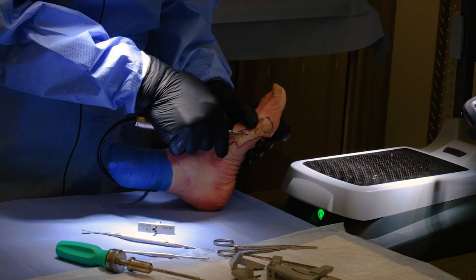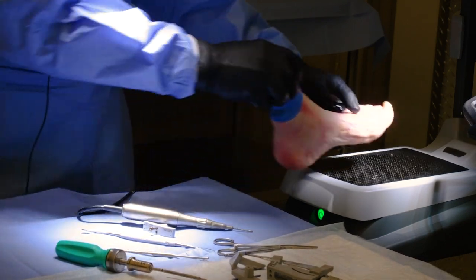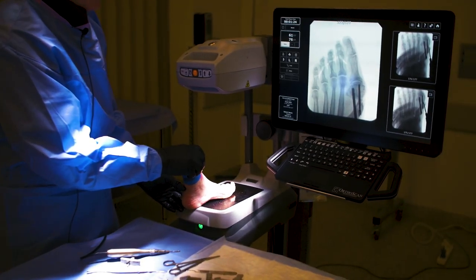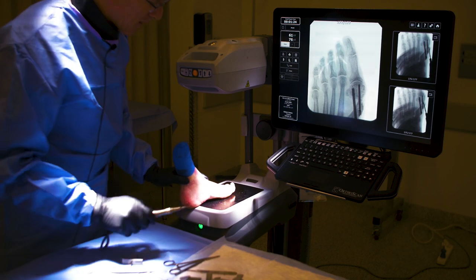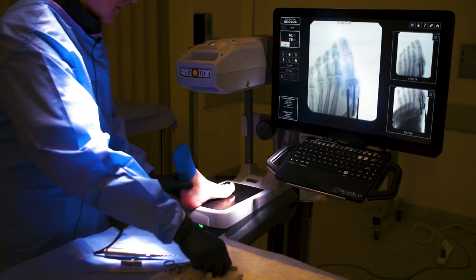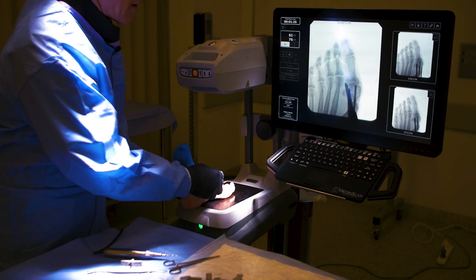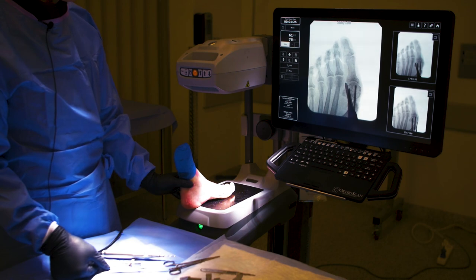I felt myself pop through; now I cut plantarly. We'll see if I've completed it — if not, I put it back in and complete. There it is — that's exactly what we want. When we're done we collapse it on itself and use the bone graft. If my medial eminence is too big, I can come through one of my incisions and take it down. If I need a soft tissue release, I can go ahead with a beaver blade, make my incision, spread down, and do my sesamoid metatarsophalangeal ligament release — whichever release I want. And if we're still not happy, we could do our Akin osteotomy.